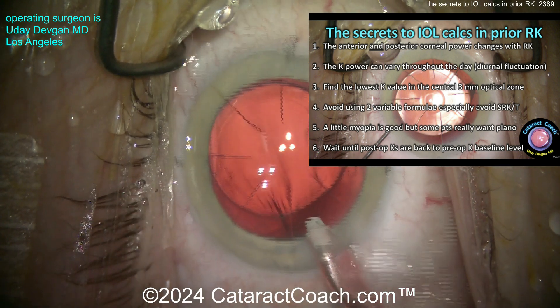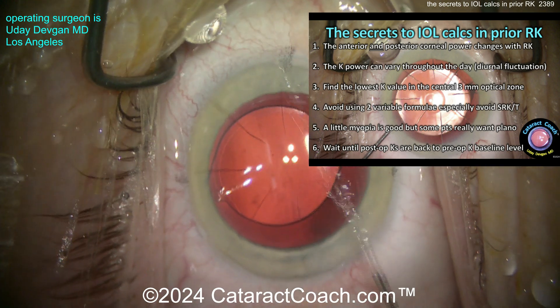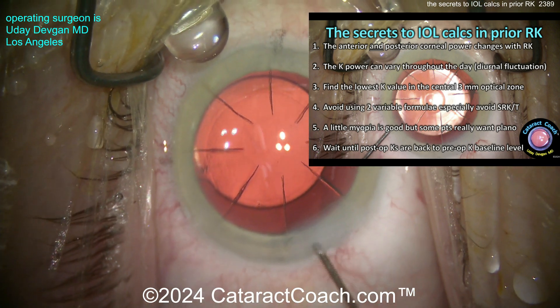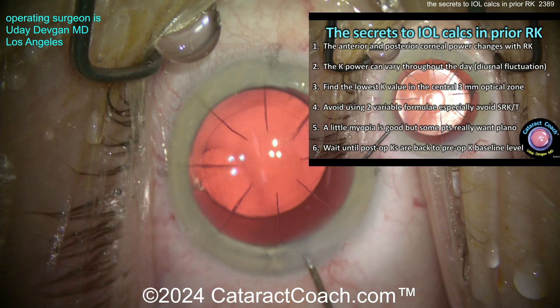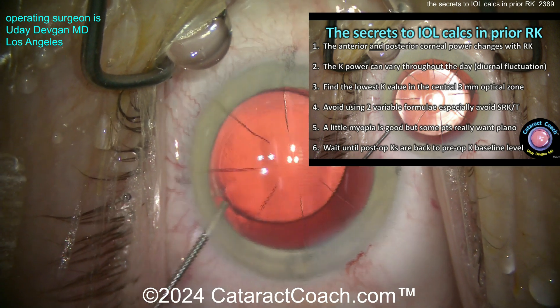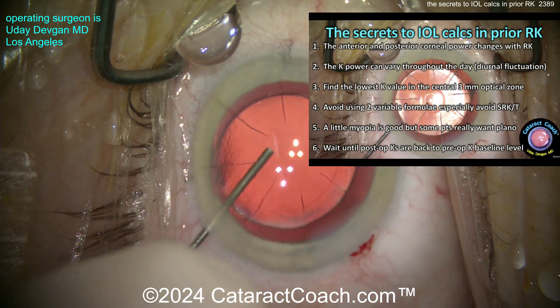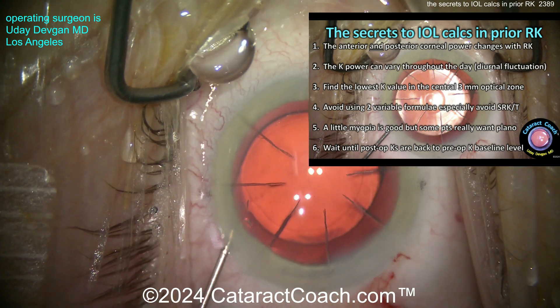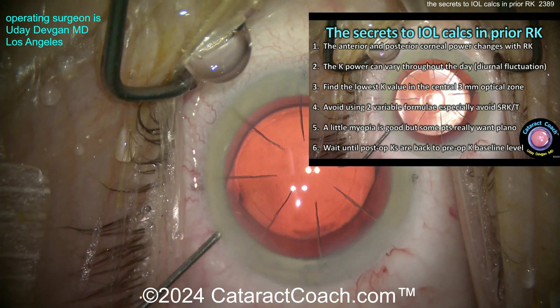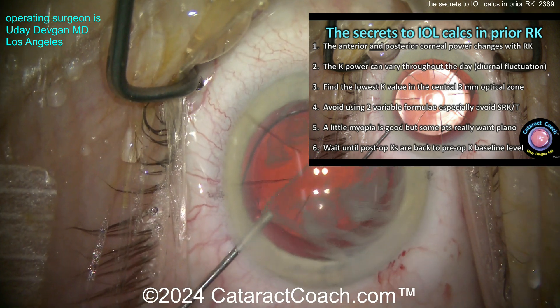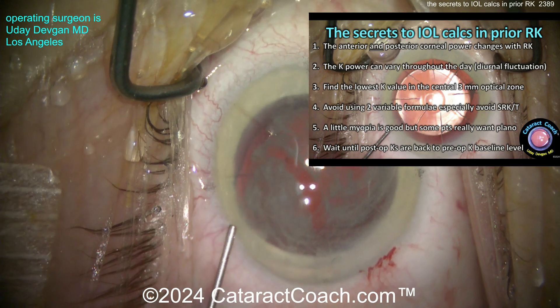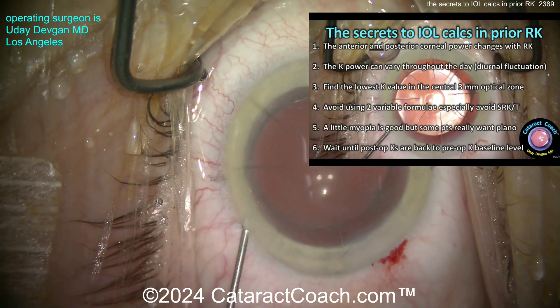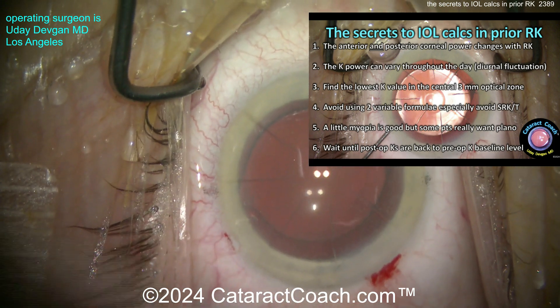In this case, I'm implanting an extended depth-of-focus toric lens to address astigmatism. The EDOF lens provides about one and a half diopters of range compared to 0.75–1 diopter with a traditional monofocal, which can help with diurnal fluctuation and give the patient better vision over a longer period during the day. The lens is perfectly centered. At the end of the case, be very careful sealing the incisions — don't hydrate the sidewalls because you could rip open the RK cuts. We're also using triamcinolone to reduce inflammation, carbachol to bring down the pupil, and preservative-free moxifloxacin for antibiotic prophylaxis. Check all incisions carefully.